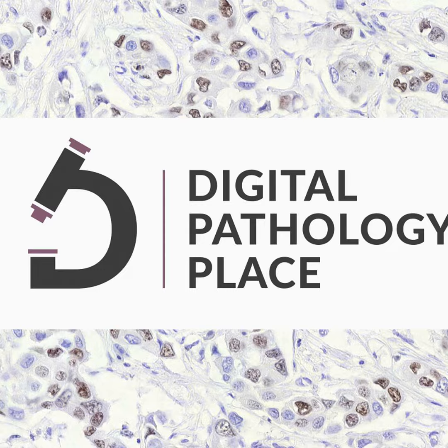And so it turns out, there's only like 3,200 slides in the study, only 6 slides out of 3,200 where the pathologist said, I can't see this at 20x, I need to see it at higher magnification. Oh, really? So that's far less than 1%. And I think, again, that's kind of what the predicate device study showed. And it also says that 20x is fine for the vast, vast majority of diagnoses that happen in general surgical pathology.